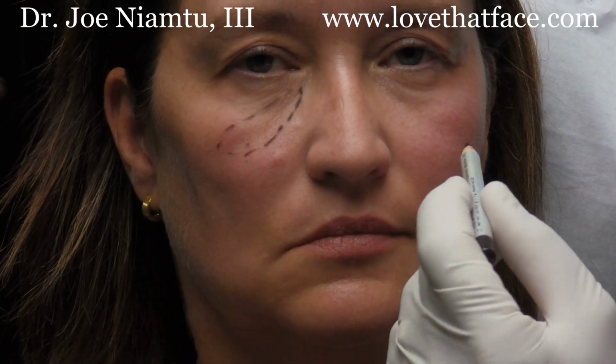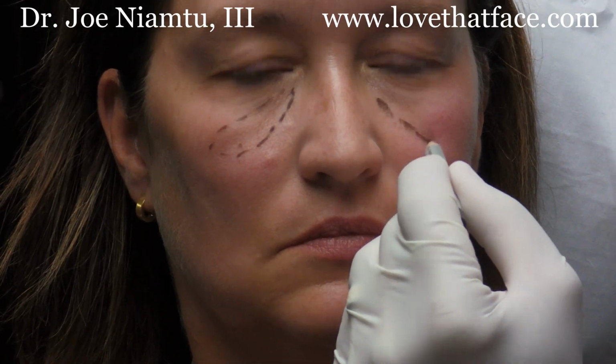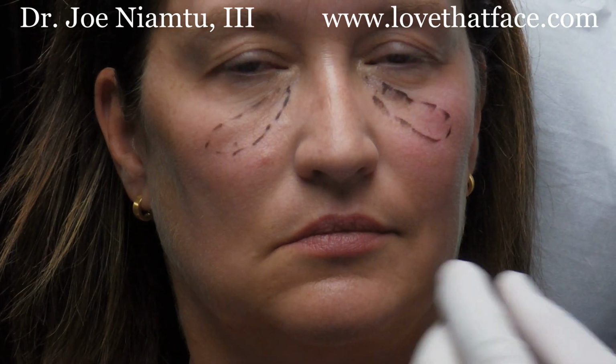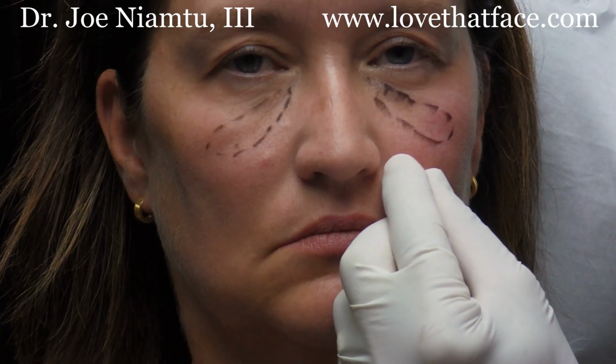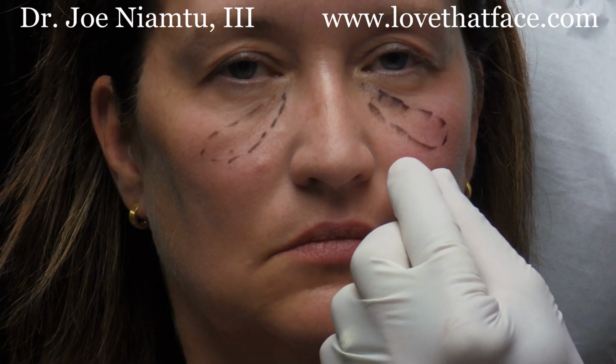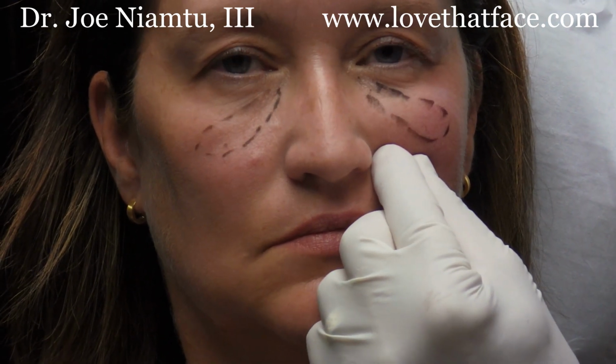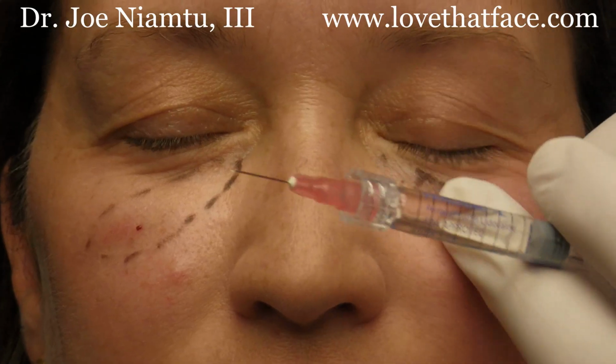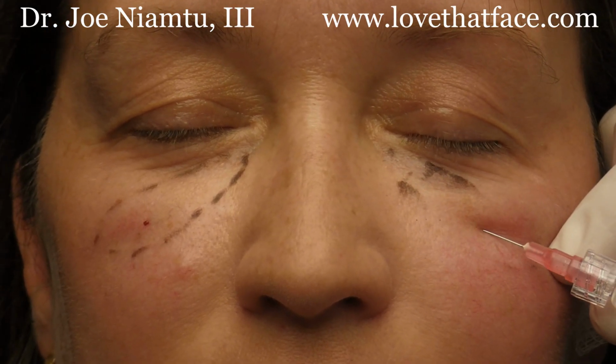That's one of my favorite little terms, and we talk about it all day long because a lot of people don't realize that these small changes can improve their mid-face volume and make them younger by going from there, you guessed it, to there. So we're going to put a little filler in this patient. All right, so we're going to put a little filler in this region that we had previously outlined.